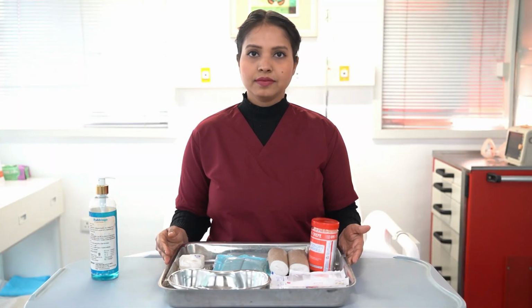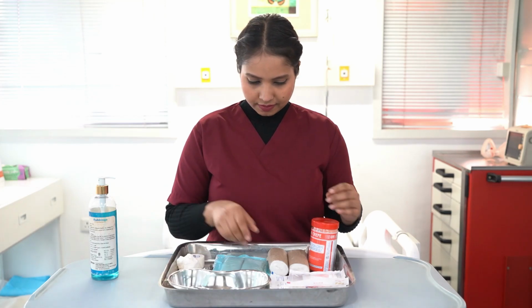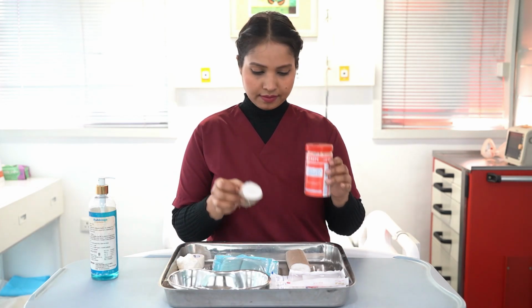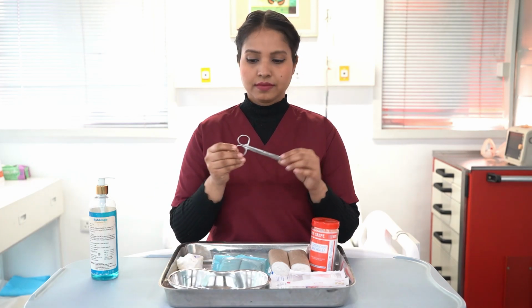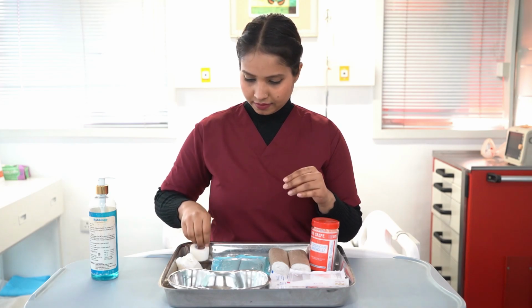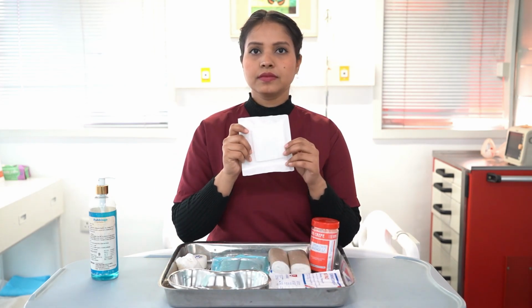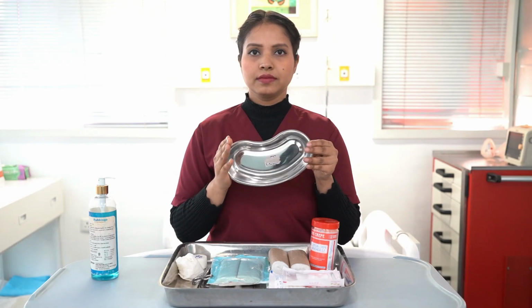Equipment required: a tray containing loose gloves, appropriate bandages, scissors, adhesive tape, dressing material like gauze, and a kidney tray.